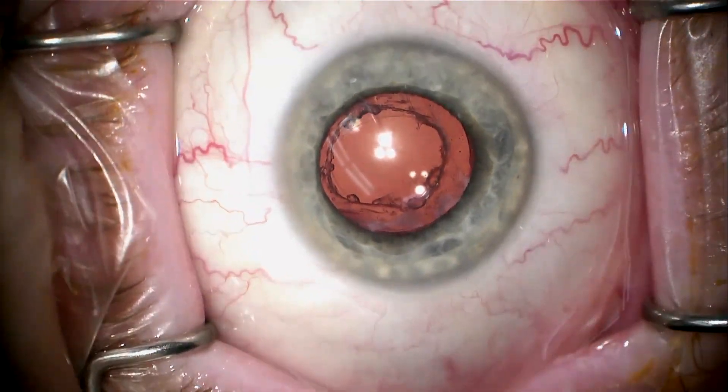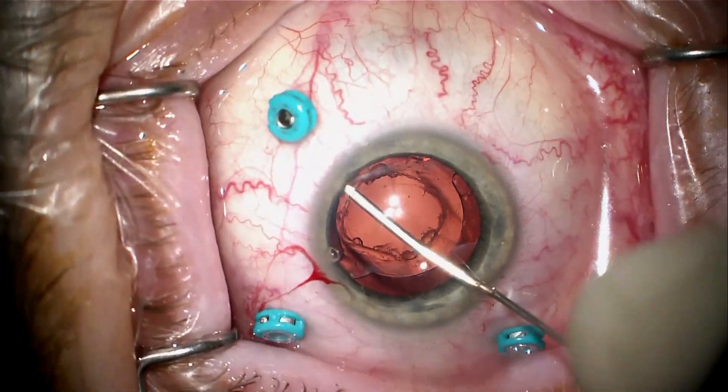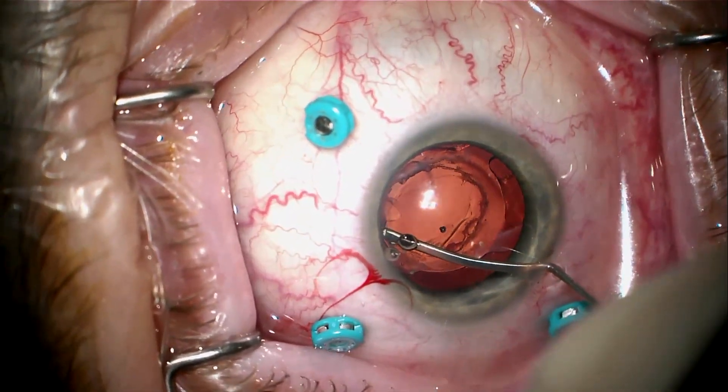This is a patient with a well-fibrosed SPL3 Clearview Hydrophilic Acrylic Lens, status post-YAG laser. We've already taken the lens out in the other eye, and here we're going after the right eye, which is the dominant eye.